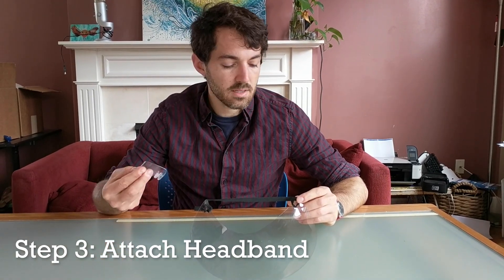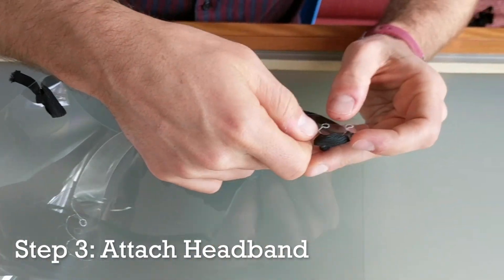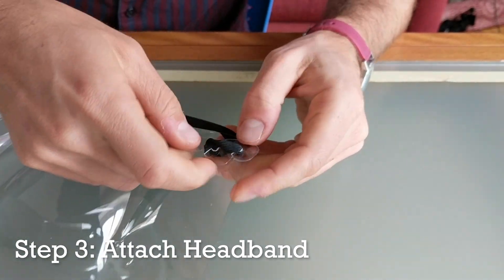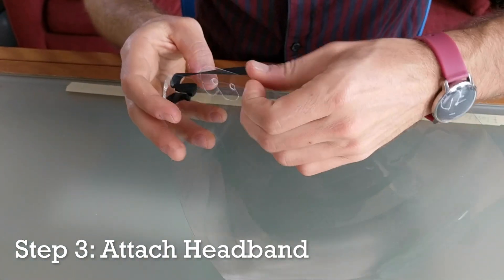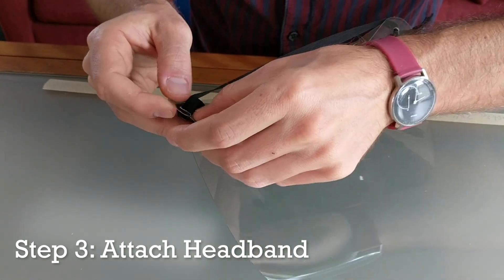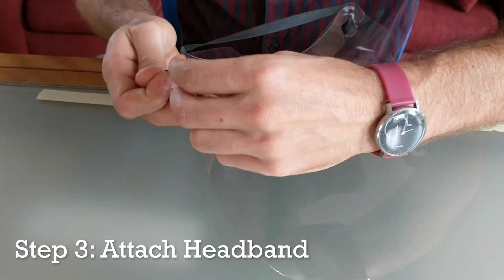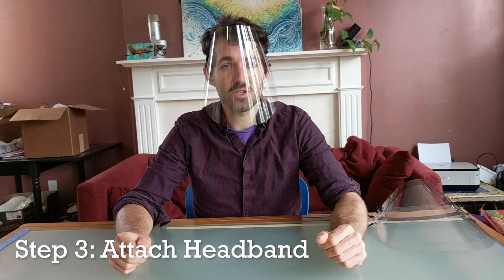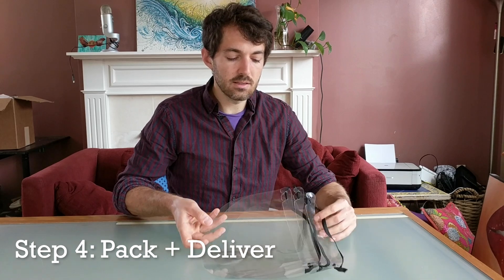Next you want to put your plastic headband, starting by putting the tongue through the loop that you've created. And voila, you have an NYU face shield. Once you've completed your face shields, you can go ahead and stack them nice and neatly.